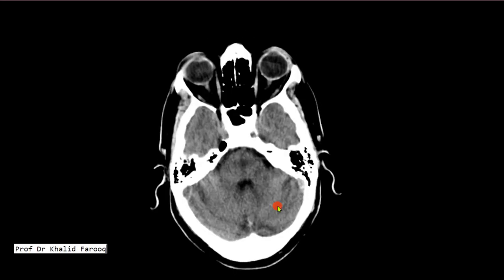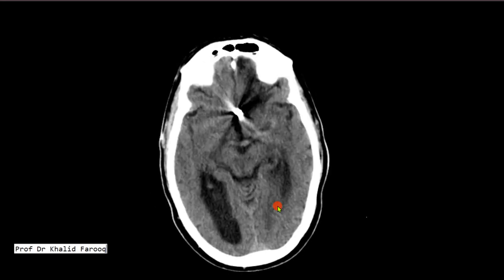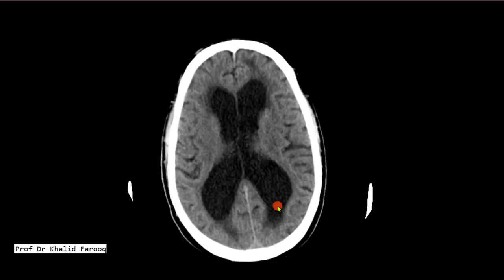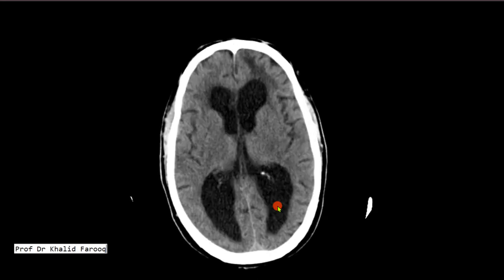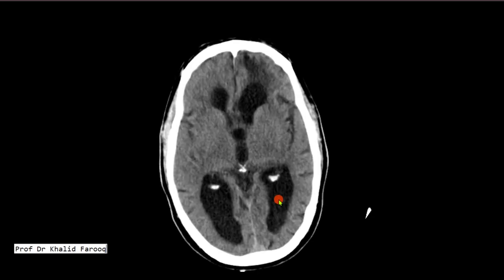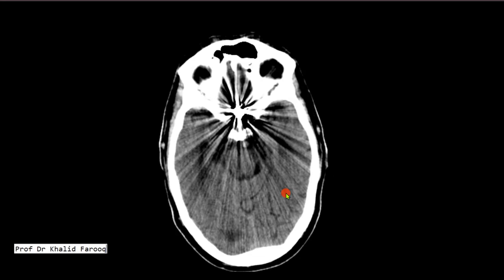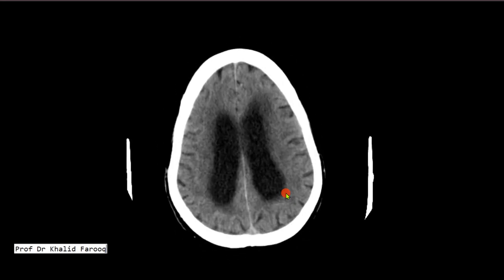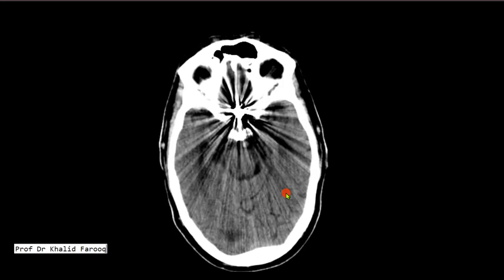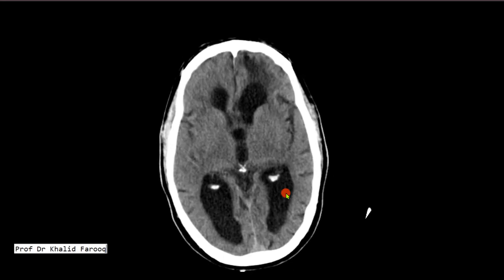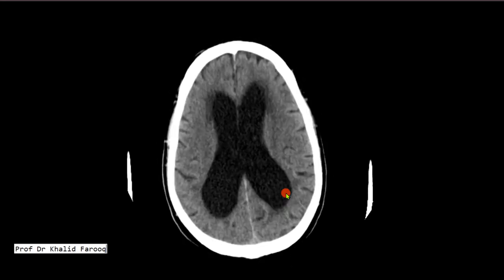This is the case of normal pressure hydrocephalus showing a dilated ventricular chain which is disproportionately prominent as compared to surrounding extra-axial CSF spaces. He had typical clinical features as well, including gait disturbances, urinary incontinence, and memory issues. Thank you very much.